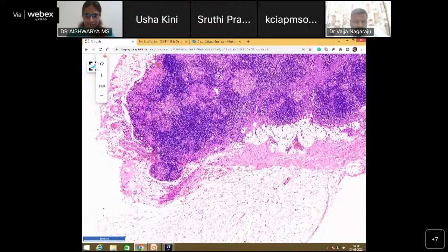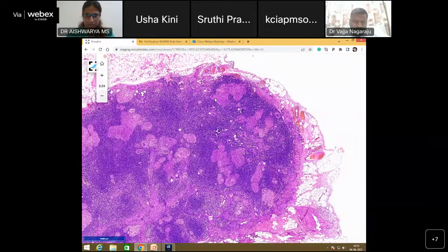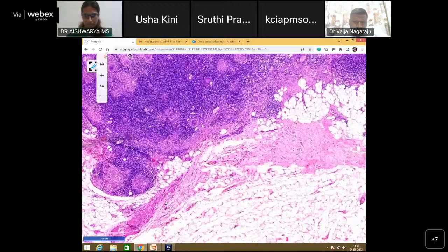So here is some amount of infiltrate which is going out, but you have naked granulomata sitting outside in the perinodal tissue. I saw it somewhere very distinct. Okay, probably here. So there is perinodal extension of this element. So now I'll just take you over to my PPT slide.